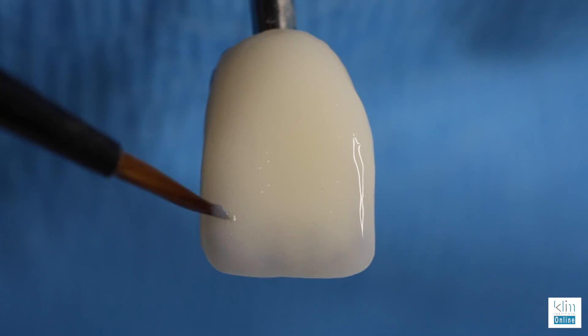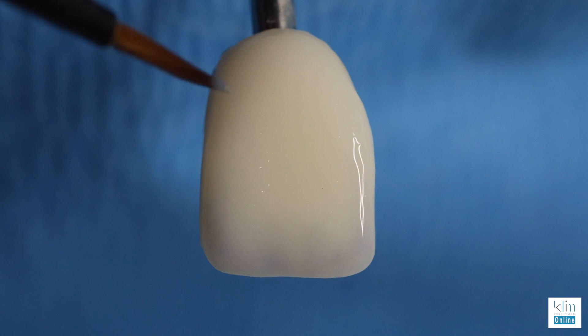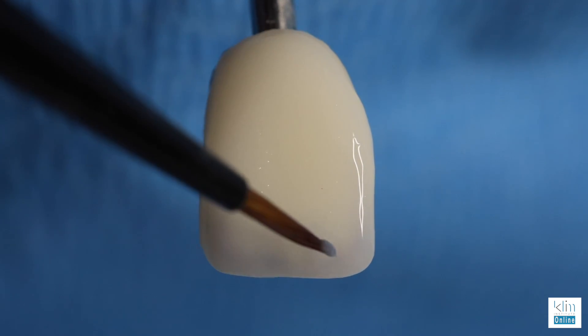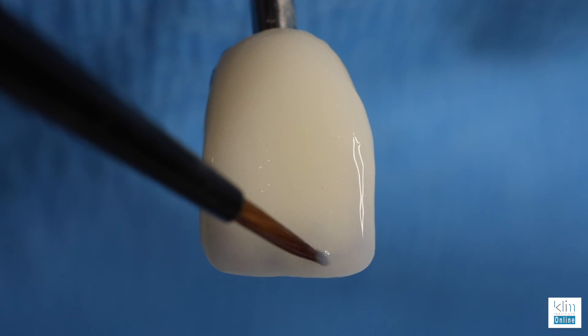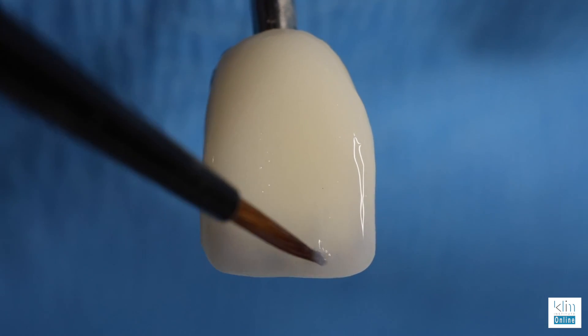Once the low value translucency effects are established for the case, the concept here is all about contrast. Often this may be as far as I go on a case, but there are other options and that's what we're going to do next.